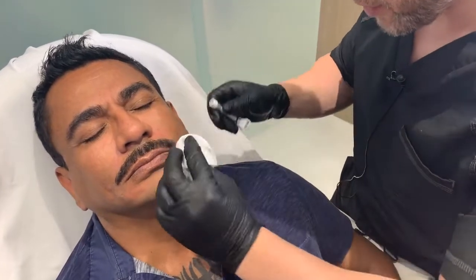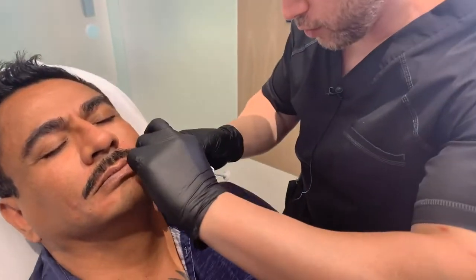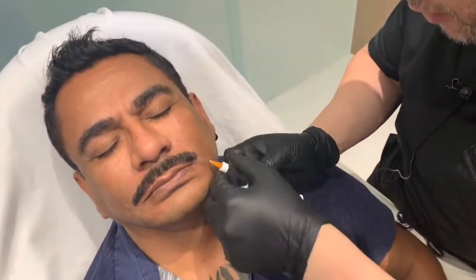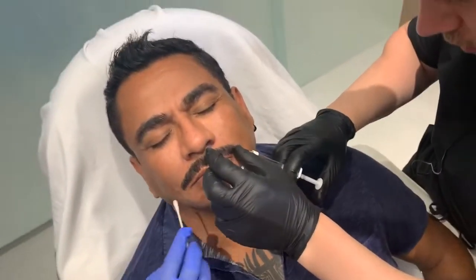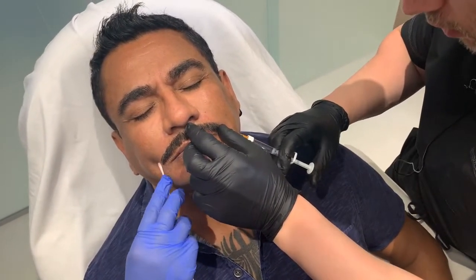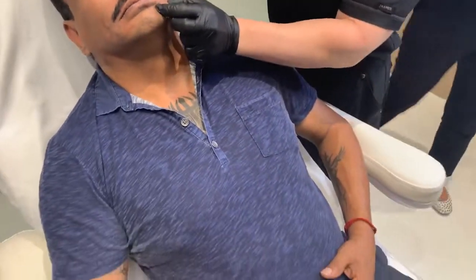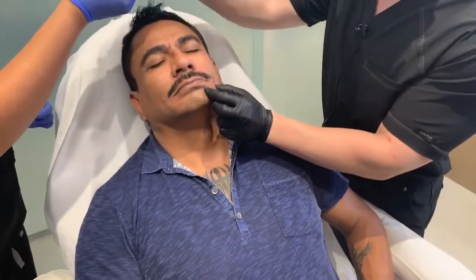Grab the last syringe. Doing a total of 3 syringes around the mouth. I think structurally he probably needs a little bit more, but this will give him a nice improvement that he's looking for initially, especially with the fold. And then let's build the structure here with what I have left.